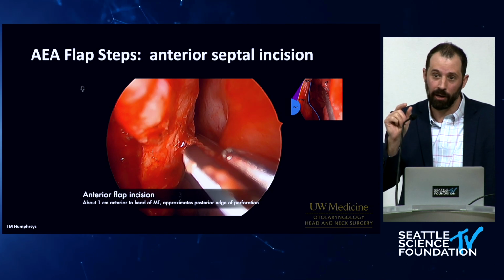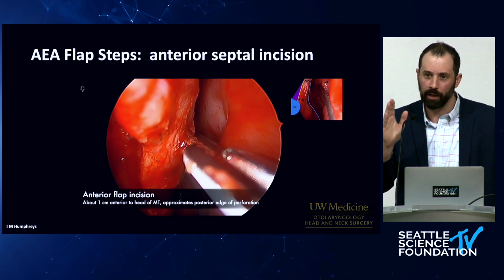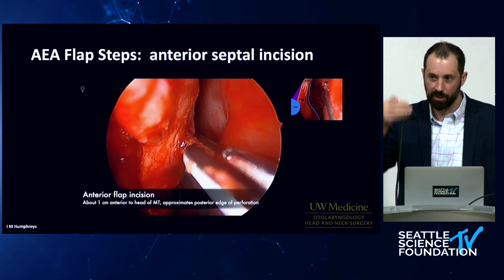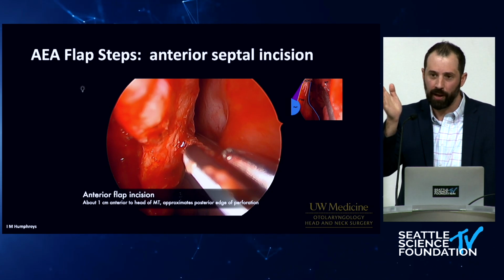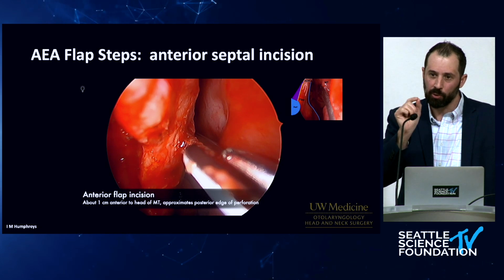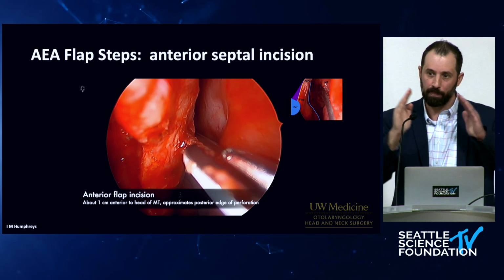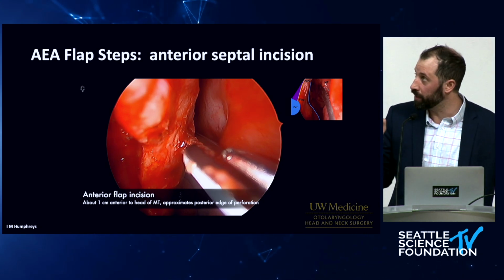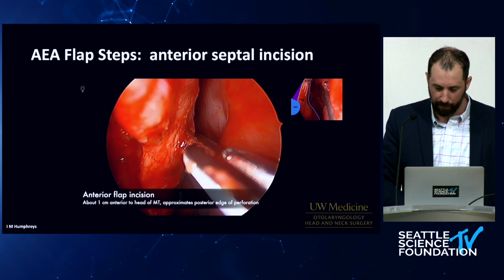So that's the part that I have found that my first few times doing this, I felt I either narrowed it or I compromised it or I didn't have the right geometry to it. The cartoon looks almost as if they're parallel. In reality, the blue incision is vertical and the yellow incision is more of a 45-degree angle. But make sure that that yellow incision doesn't come posterior to intersect with your initial vertical incision. So there's a separation, and if, again, looking at that insert, that's the perfusion point. That's the pedicle that's going to supply the flap.